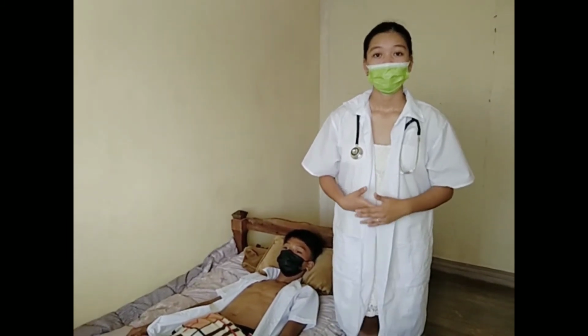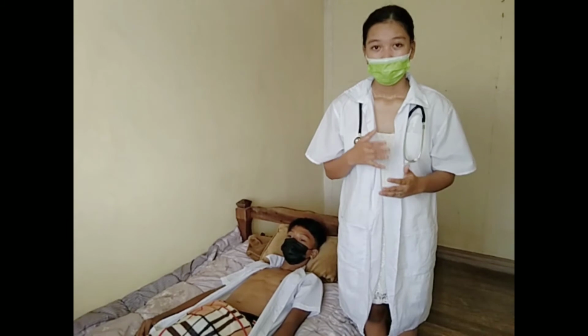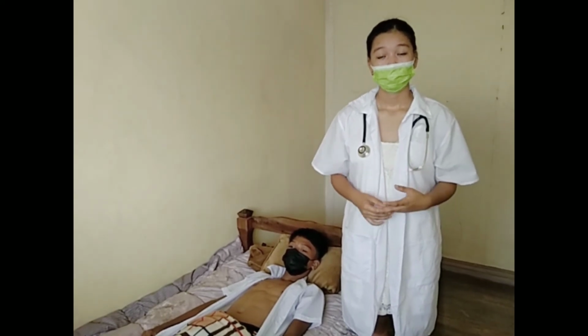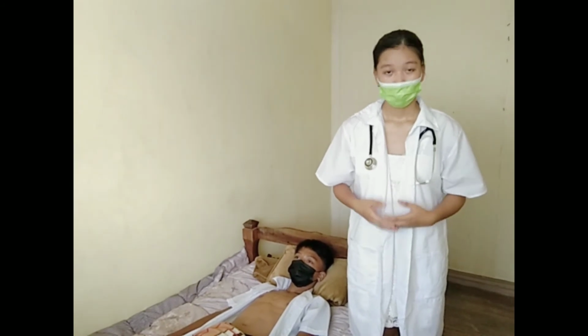Use the diaphragm of the stethoscope first, then the bell, then auscultate the heart in four anatomic sites such as aortic, pulmonic, tricuspid, and mitral for heart sounds. Ask the client to breathe regularly while auscultating. Repeat the preceding steps while the patient is in the left lateral position. Then in a sitting position, leaning forward, briefly stop breathing after exhalation.